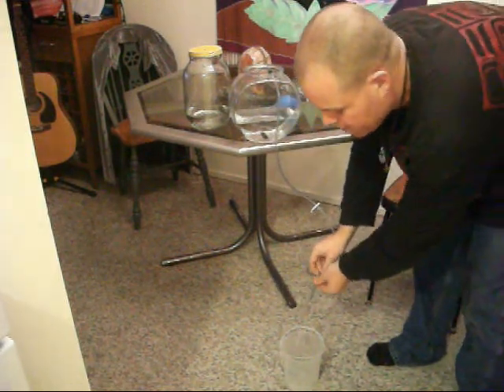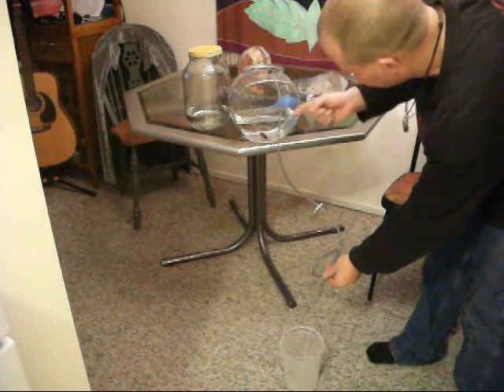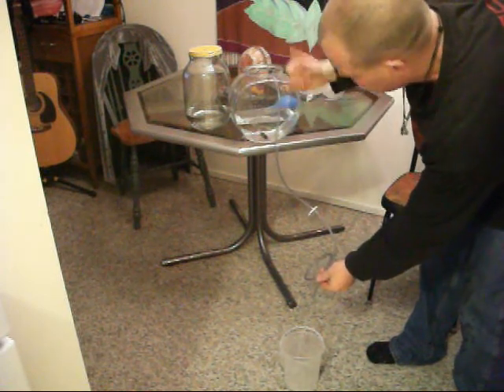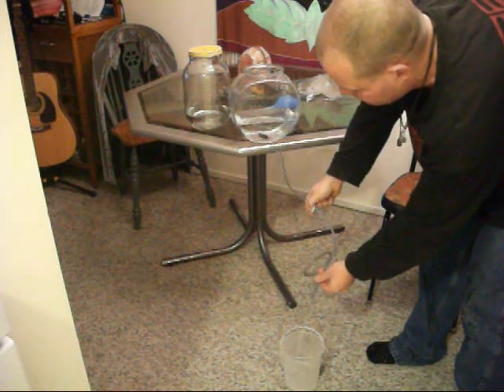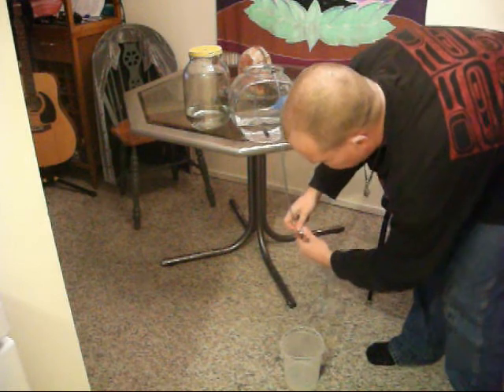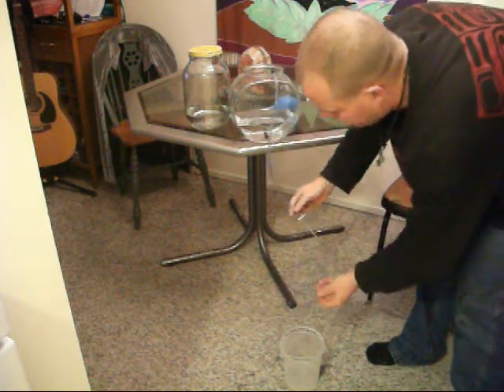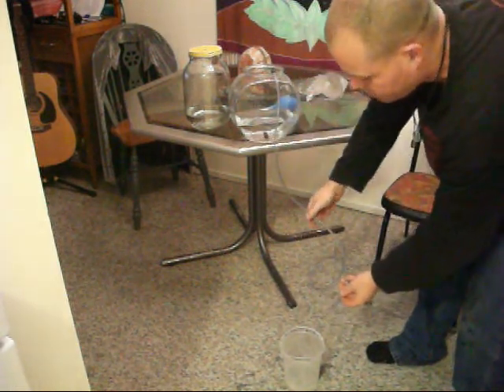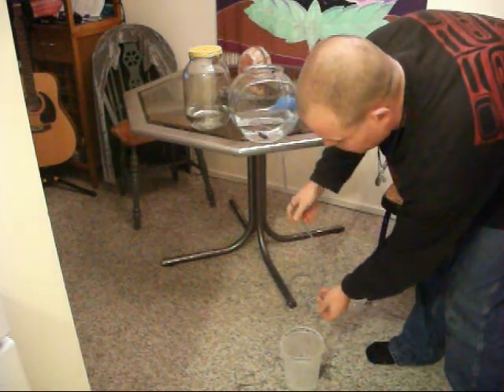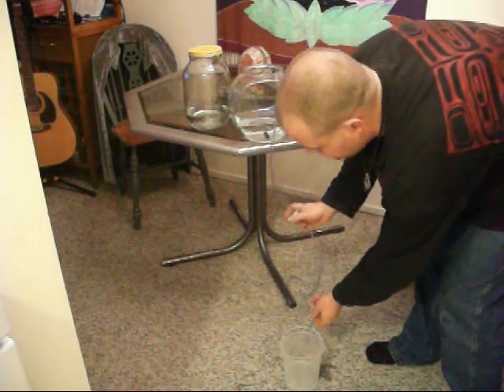But if you have stuff in there you don't want to taste or whatever, you just put it in a tap and then close this off. You have it go down there, you turn this off, and then you stick it in and you just turn it on and it'll go. So it's the siphon principle.